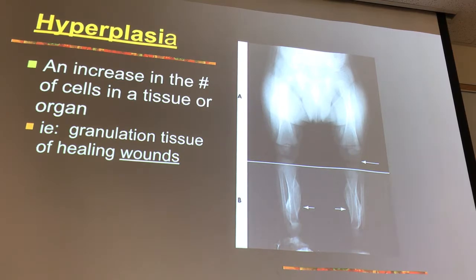Shuts off. Shuts off when it's happy, for whatever it was programmed for. And what's its weakness? Perfect positioning over a photocell. Yes, you are its weakness. If you go in a shoulder and you do not put the humeral head over the AEC, you're done.